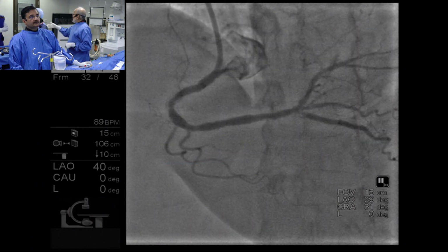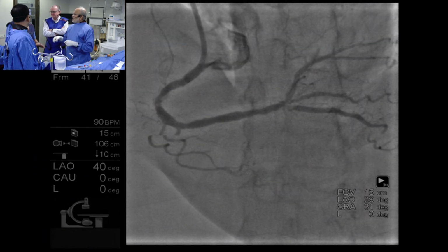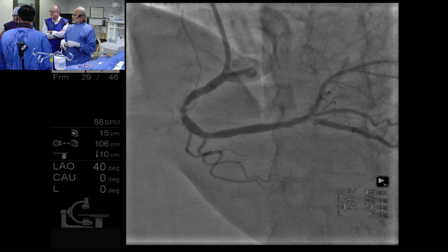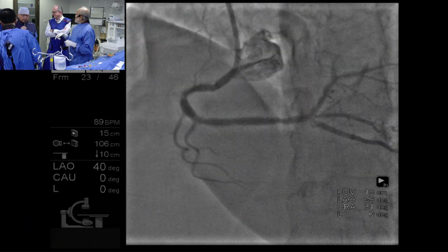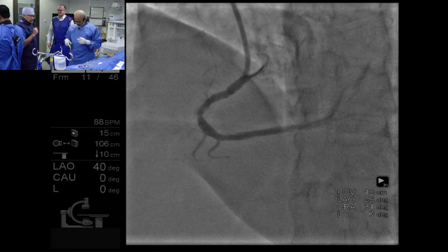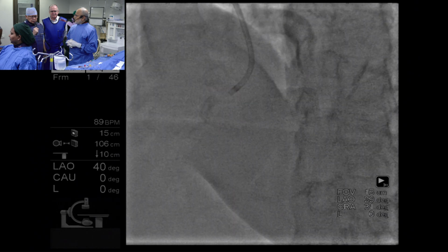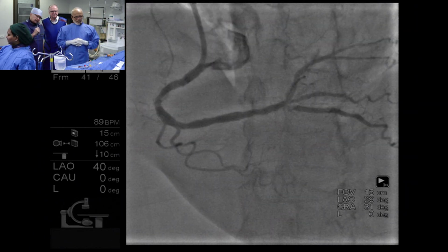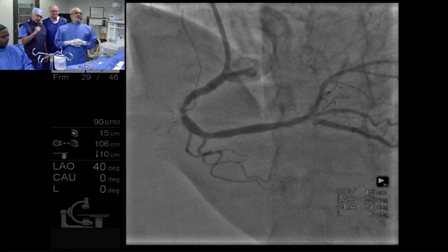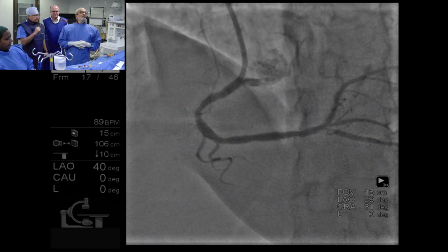About distal, it seems close to do provisional and open the other orifice of the right artery, that will be okay. One stent technique will be enough for the distal part.